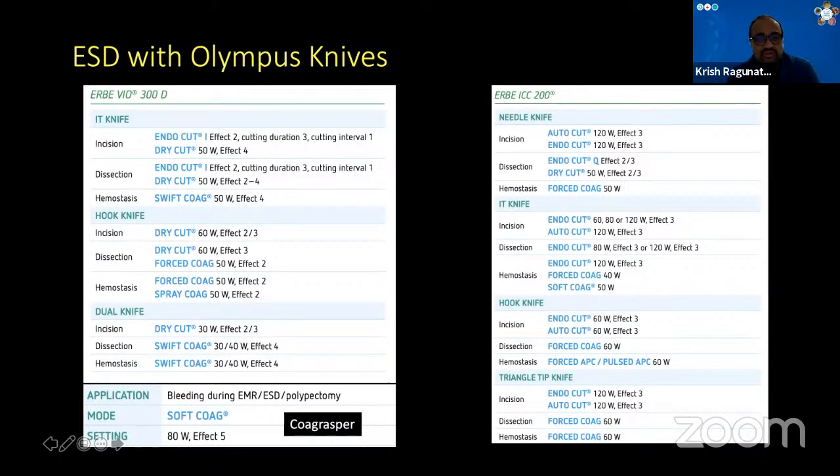No, I stopped doing ESD here when I came to Australia because a couple of my other colleagues have been doing quite a few. So I'm not doing ESDs now. But when I used to do ESDs, I used to use forced coagulation or soft coagulation for the bleeders, and forced coagulation I was using. Prakash, what currents do you use?